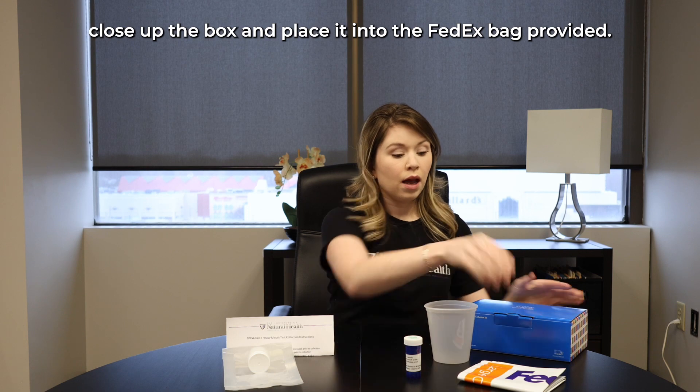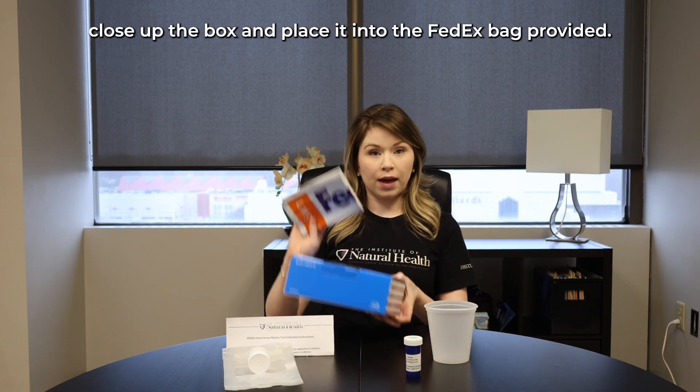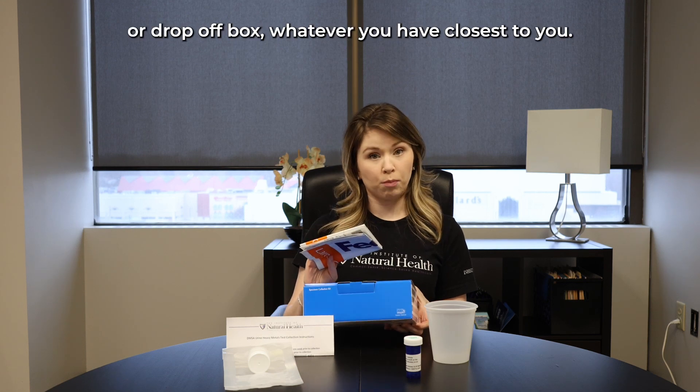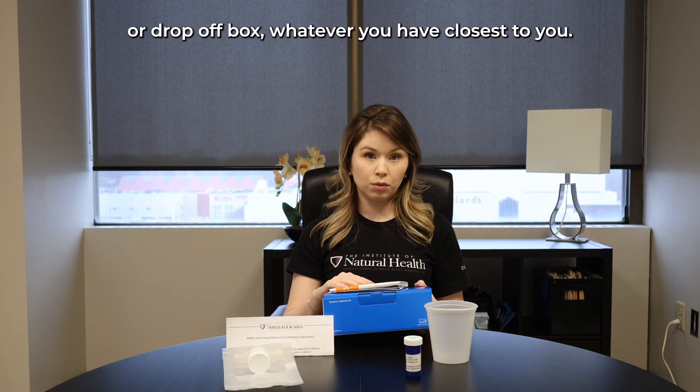Once you are ready to mail your kit, you will take your specimen tube and your test requisition form, place it into the box, close up the box and place it into the FedEx bag provided.